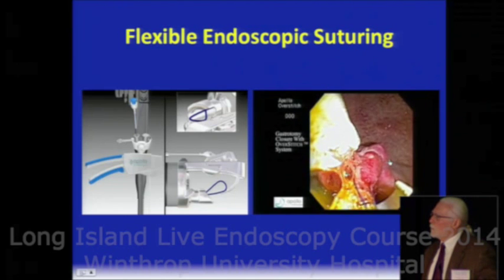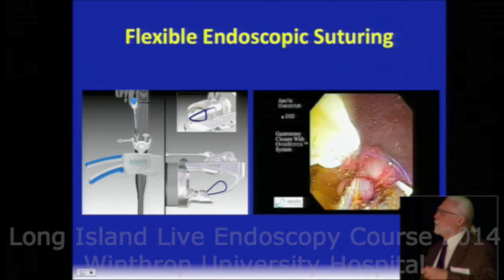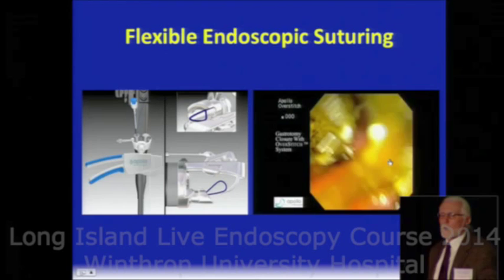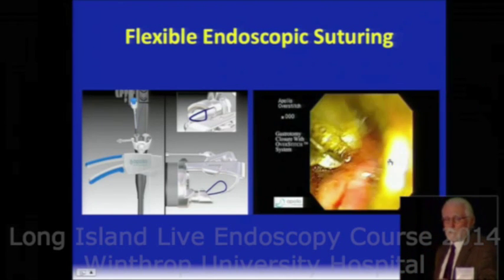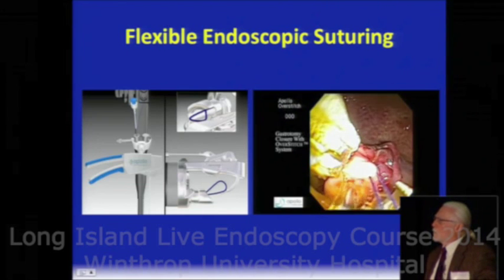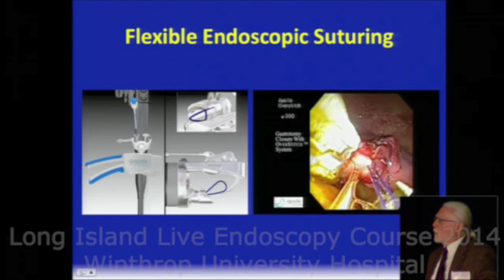And then these are literally pulled together, and as a result that compresses the tissue. And so rather than a clean suture line, you'll see more of a compressed suture line. Very effective, as you can see from the bursting pressures that I showed you in the slide before. It's tremendously sound, and it should allow a confident closure.